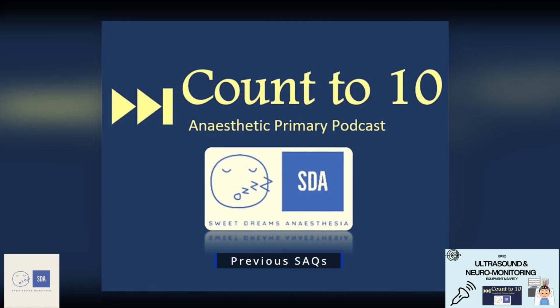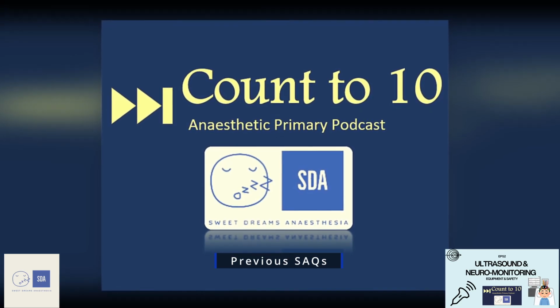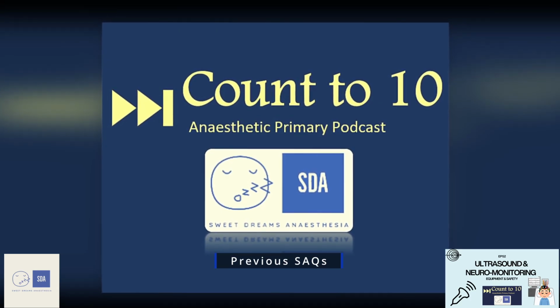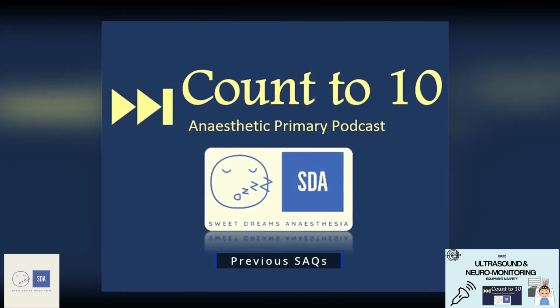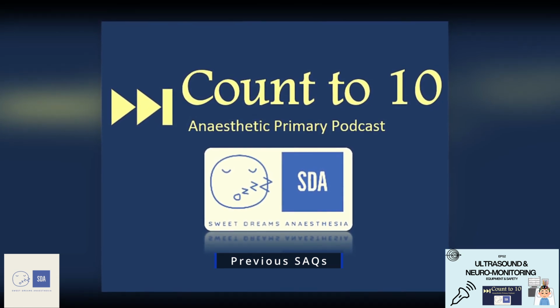This phenomenon of creating sound waves is referred to as a piezoelectric effect, and you'd put that somewhere in this answer. From there, my next heading would be, what happens to the sound wave after it's generated? And here I would put that the ultrasound wave goes through attenuation, and that attenuation is caused by 4 factors. This is either reflection, refraction, scattering, or absorption. And then out of these, reflection is the only form of attenuation which allows for image generation.